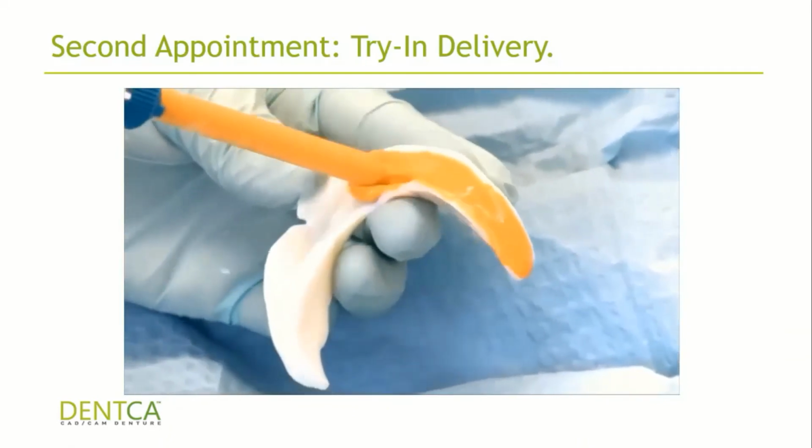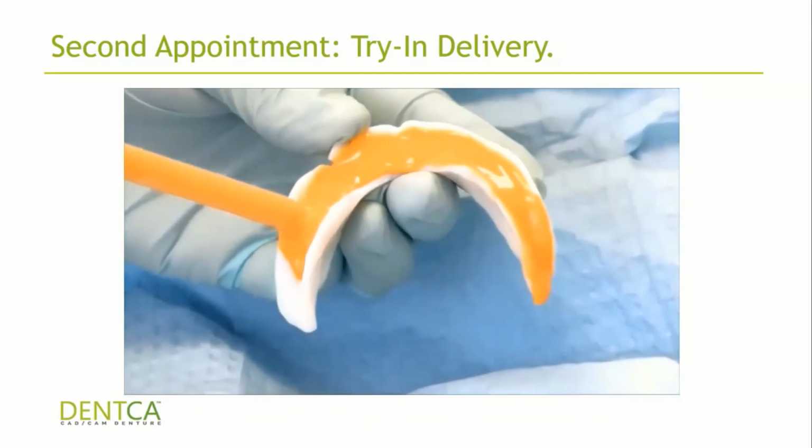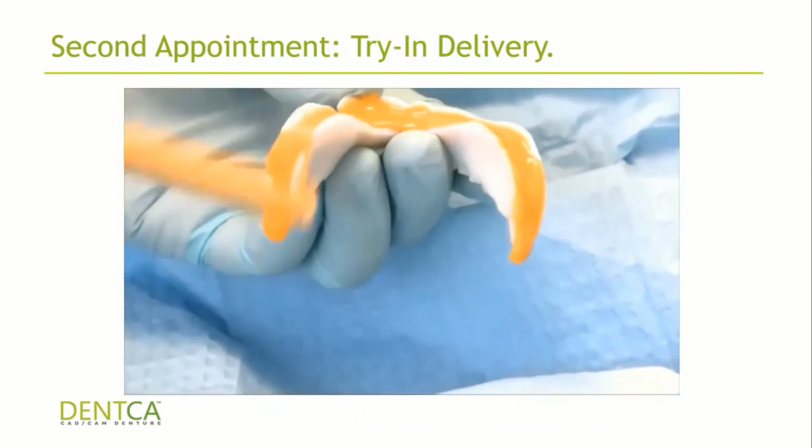Then they're going to do the same thing with the lower. And then they're going to check the bite. So the last part will be adjusting for the bite.